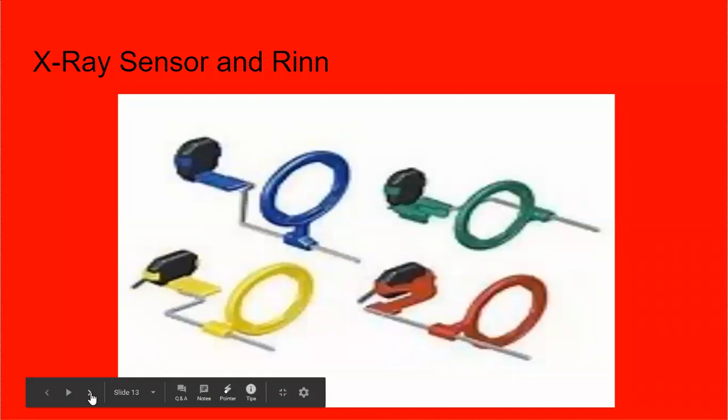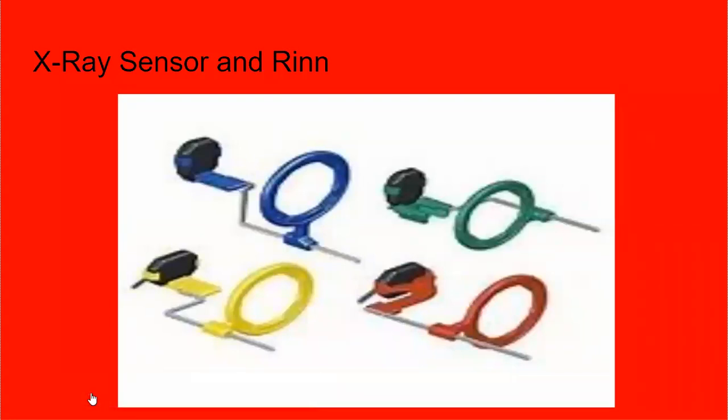You must take an x-ray before and after the procedure is completed. There are a couple of different reasons why. First of all, you need to prove the root canal is needed. If the patient has insurance, you need to take the x-ray of the tooth prior to having any treatment done to it so that you can prove that it needs to have a root canal.